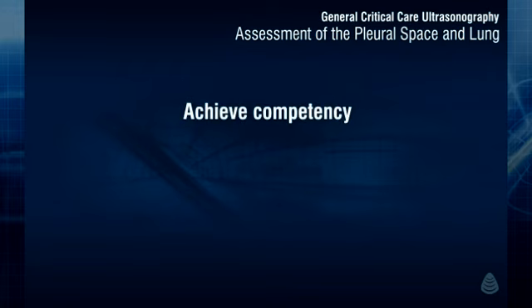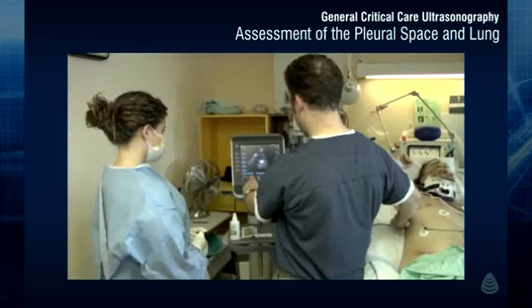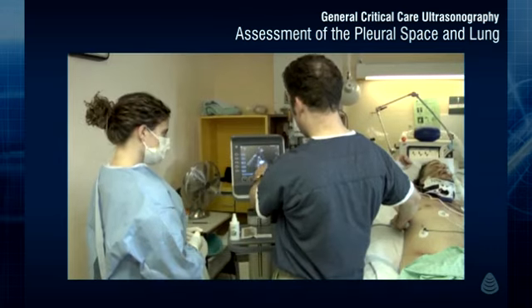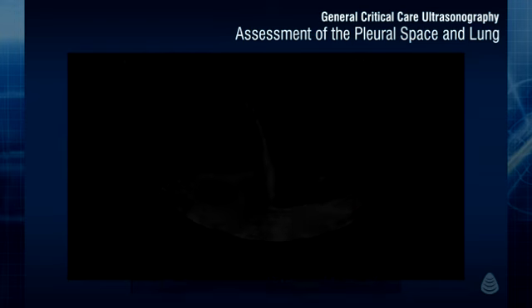Achieving competency in the focused assessment of the pleural space and lung requires integration of technical skills, that is, image acquisition, with cognitive skills or knowledge base, that are image interpretation and clinical applications. Lung ultrasound can be routinely performed at the bedside by the intensive care unit physicians and may provide accurate information on lung status with diagnostic and therapeutic relevance.